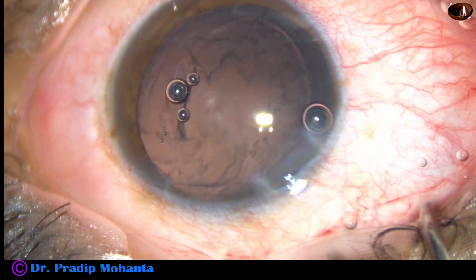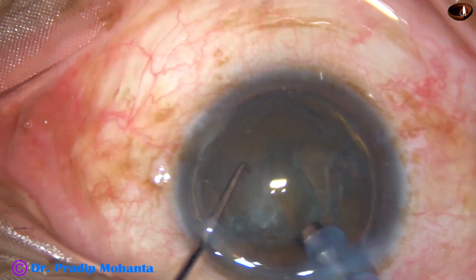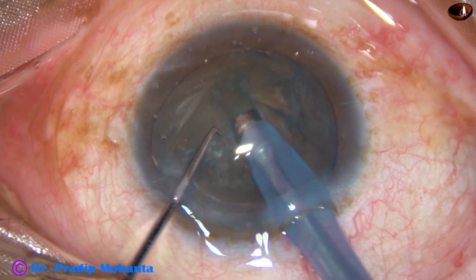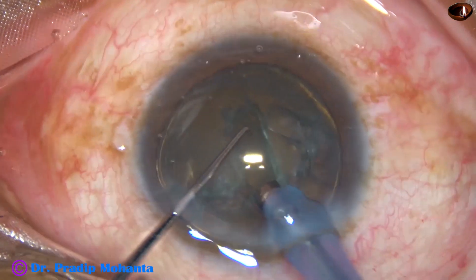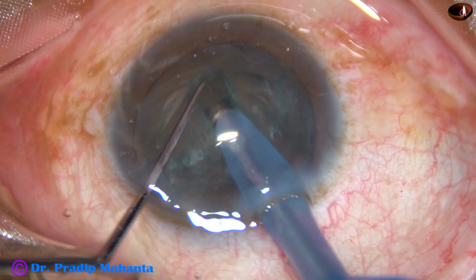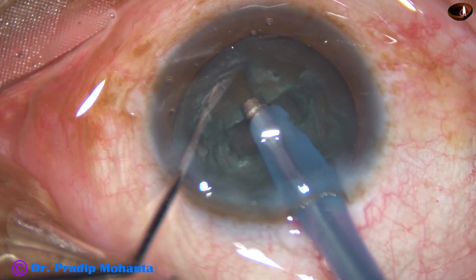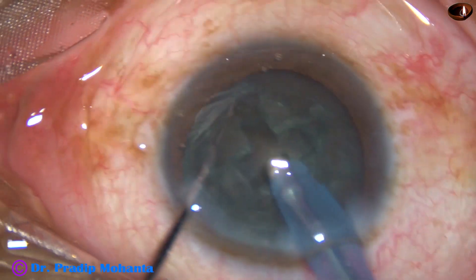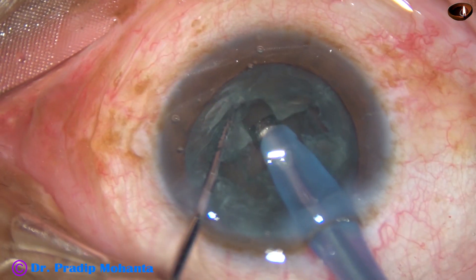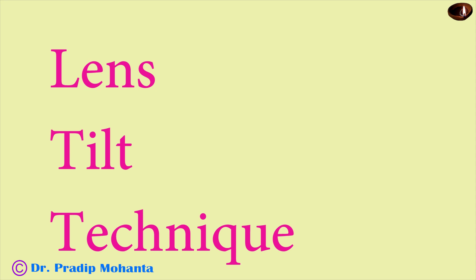Now let us see this divide and conquer technique. This is a universal technique which can be utilized in all types of cataracts. In soft cataract, the tip and trick is you must make a narrow and deep trench. The trench should be as long as possible, but narrow and deep, and we should not break the walls.